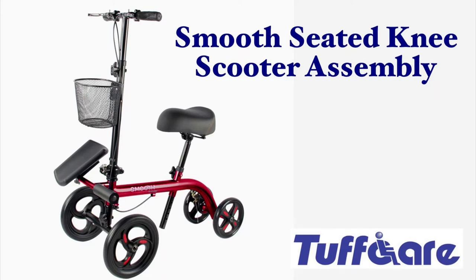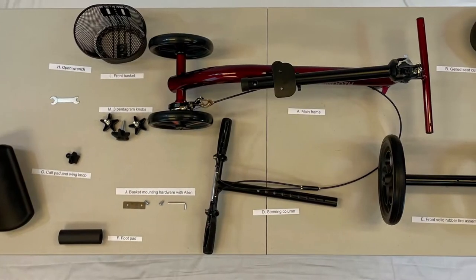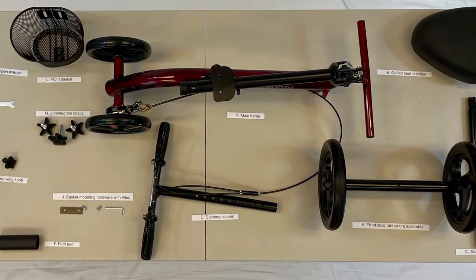Tuftcare Smooth Seated Knee Scooter Assembly Video. Once you have received your product, lay out all the pieces and make sure you have them all.